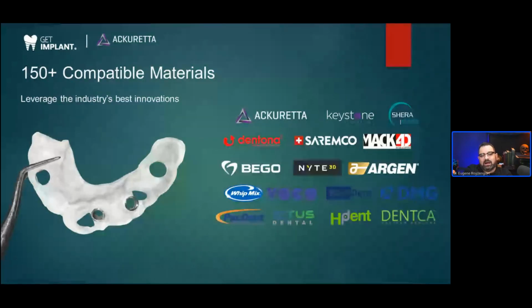It's a little bit more complex to input your own resins in here. It's still doable, just a little bit more complex. But they constantly keep adding stuff to it, and the list is fairly big. So that makes it a little bit easier to dial things in and work with.